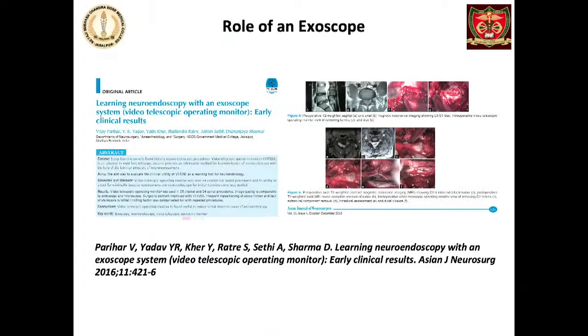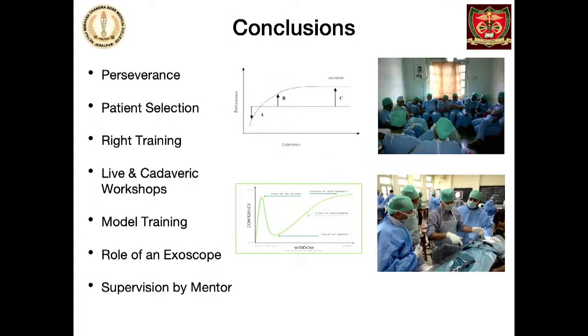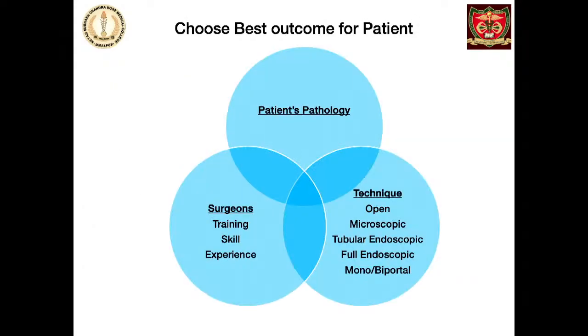So one can start with simple to complex cases, attend the model hands-on cadaveric dissection. And there are simple tips and tricks that can be learned from the mentor or from the literature to avoid the complications. We are using the Exoscope. Exoscope is a very good tool. If you have it, then it gives you a lot of experience to learn these advanced techniques.